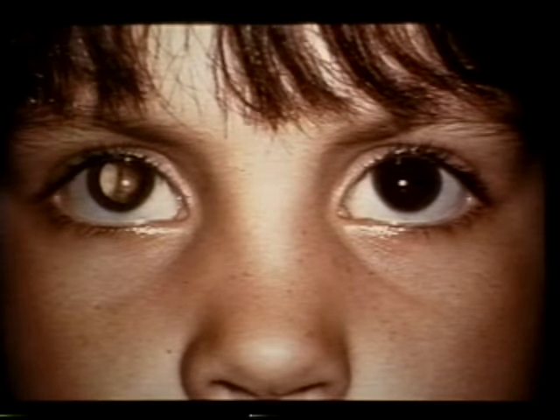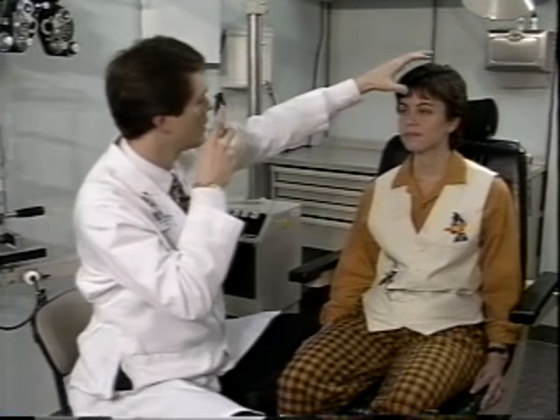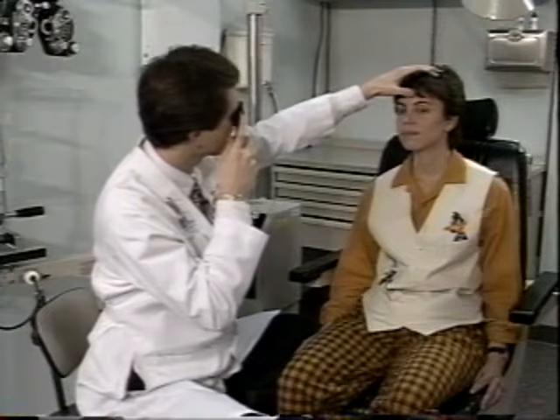Here's a patient with an abnormal red reflex in his right eye. Here is a partial cataract causing an abnormal red reflex. Next, move slowly closer to your patient's eye, keeping your red reflex directly in the center.